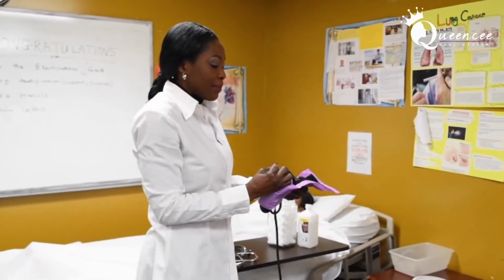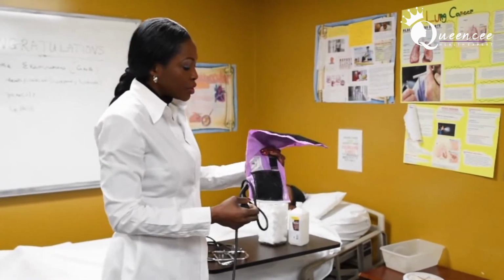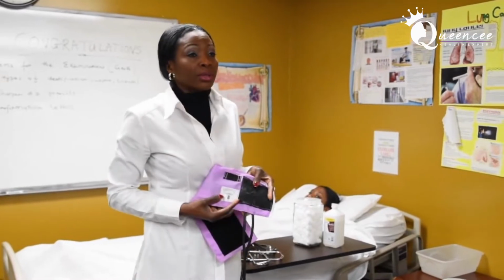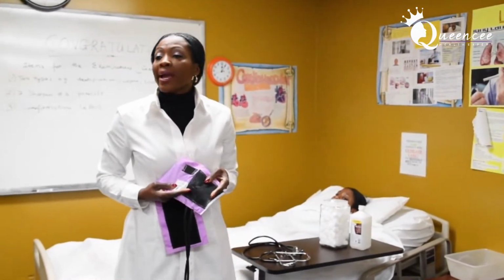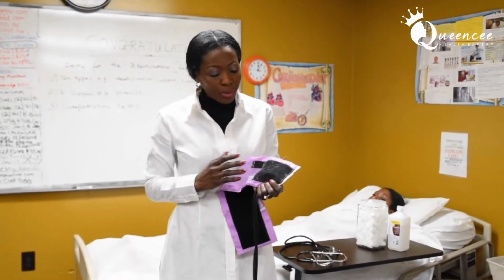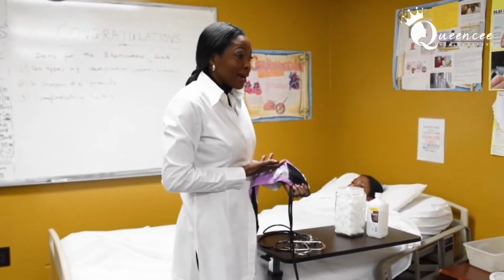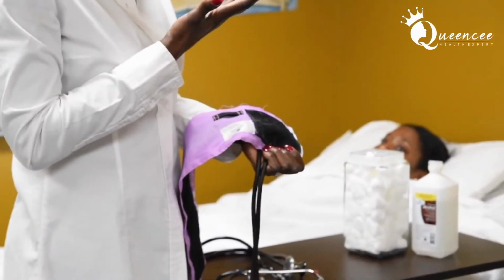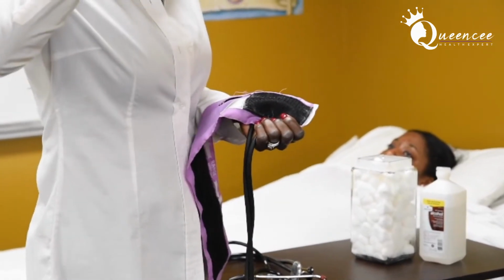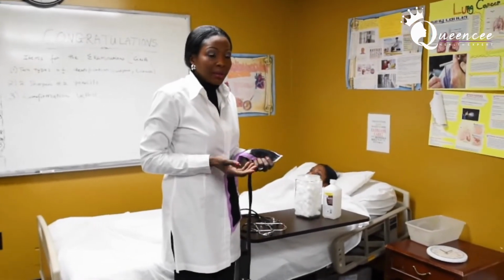Of course, this is our blood pressure cuff. We all know what a blood pressure cuff looks like. And when you take the blood pressure cuff, we said this area is also very important. It's guiding you as to where you might place the diaphragm of your stethoscope. It has Velcro. You always want to make sure that when you wrap the cuff, this area is facing you, in order for you to hear the patient's blood pressure. You have to wrap the cuff correctly.